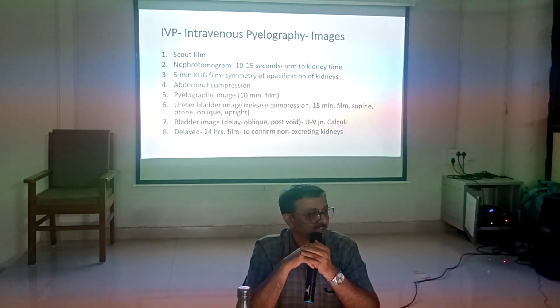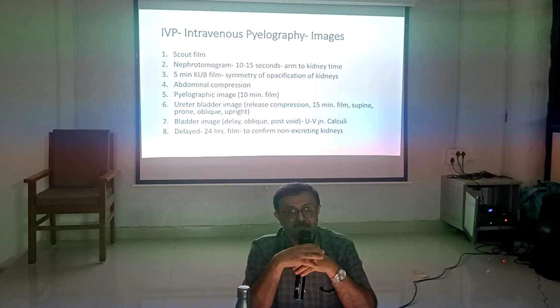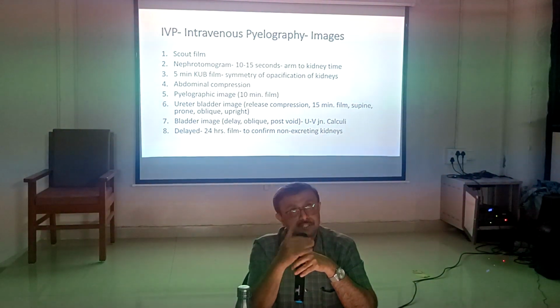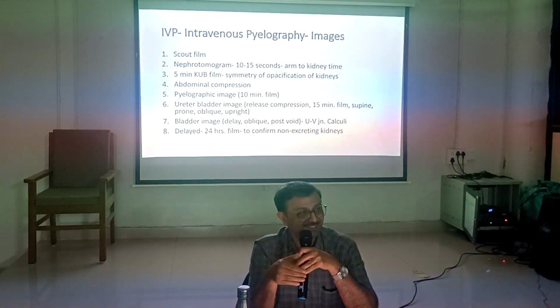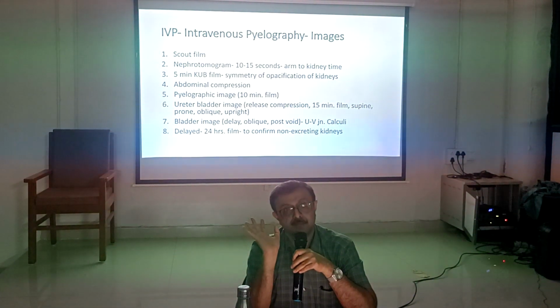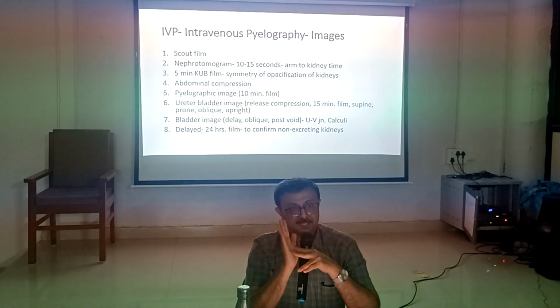See, the stone has come down. So now the pelvic stone becomes a lower ureteric stone. The incision is placed above, but the stone is below. For the latest status of the stone, always a plain X-ray. To look at the stone, the best X-ray is a plain X-ray.